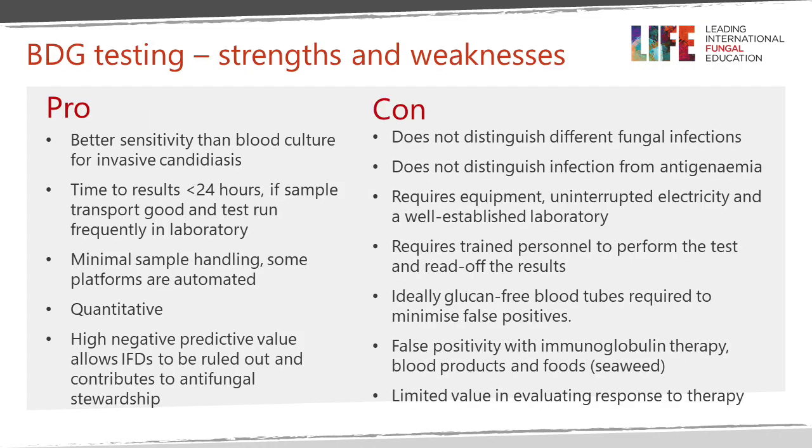So in terms of strengths and weaknesses for using this assay in the clinical laboratory, the strengths are that it has a better sensitivity than blood culture for invasive candidiasis. The time to results is short, assuming that the sample is received in the laboratory rapidly and the test is run frequently. There's minimal sample handling, and indeed some platforms are semi-automated or completely automated, which makes life easy for the laboratory. It's a quantitative assay, and it has a high negative predictive value, so that invasive fungal infections can be ruled out in the vast majority of instances, and this can really aid with antifungal stewardship.